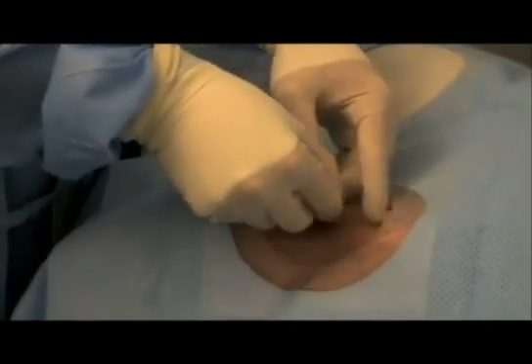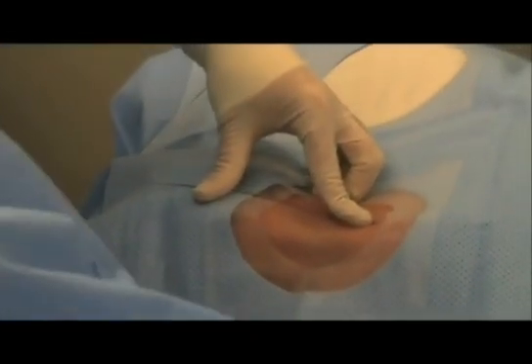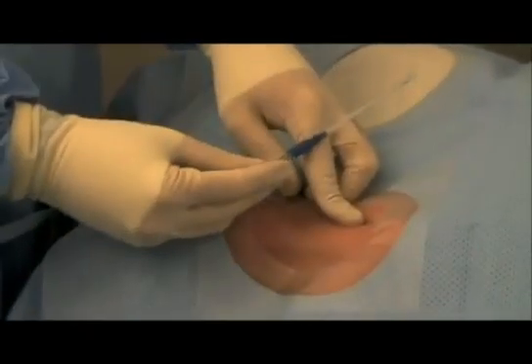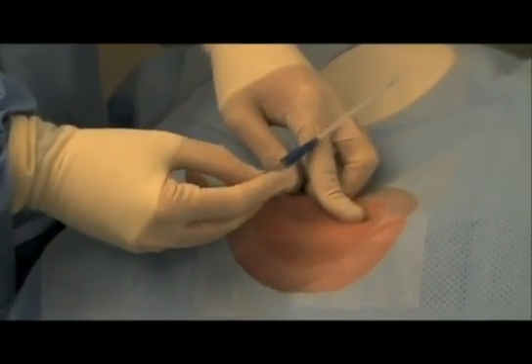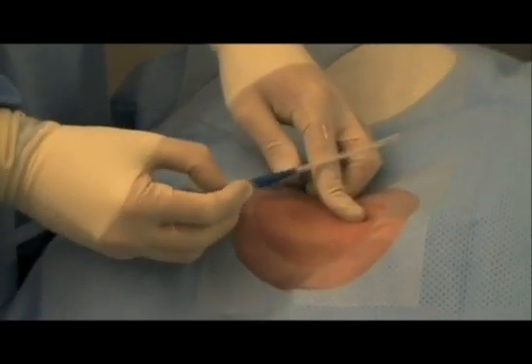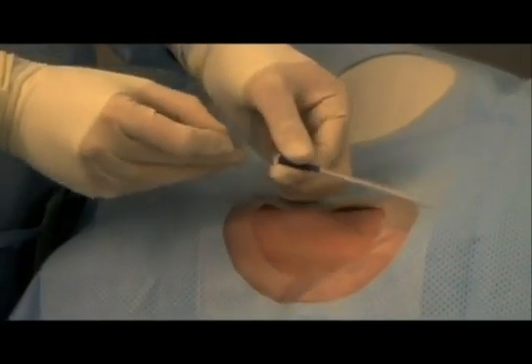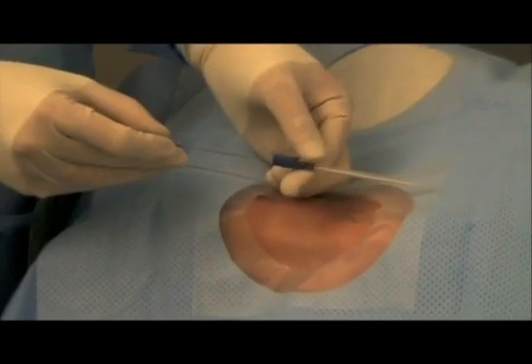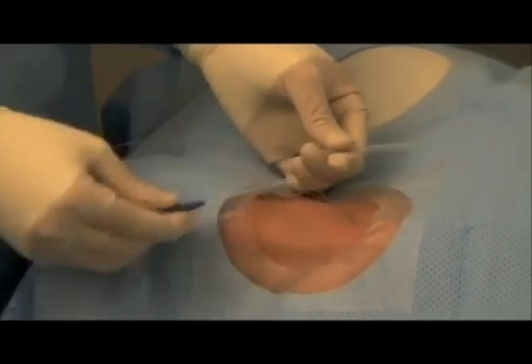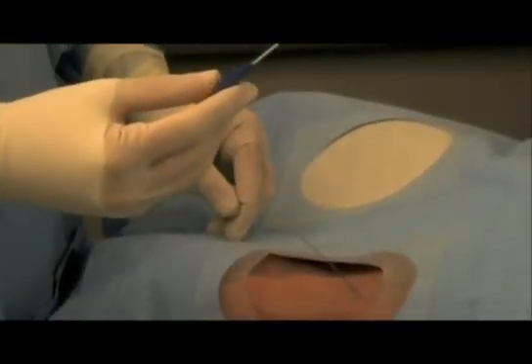What I like to do now is take off the needle. In every single kit there's an angiocath over a needle and it looks just like this. It's actually there because you could place an IJ with this angiocath instead of the introducer needle — you'd pop in, get your flash, and then advance that angiocath in instead of putting the wire directly into the needle. Some folks like that, like anesthesiologists, and it's not my preference but it's fine to do. But we're going to use it for a different purpose.